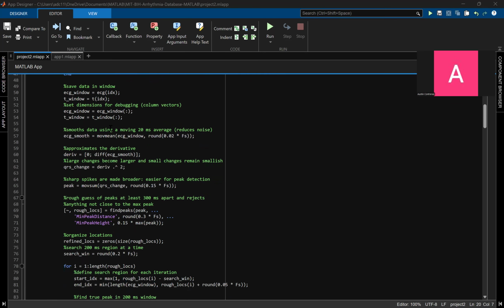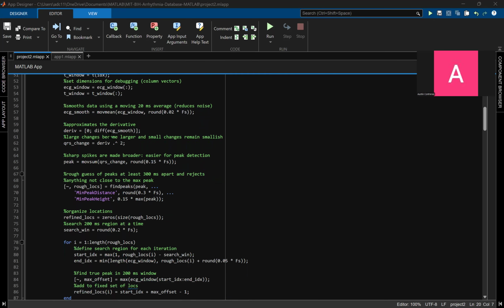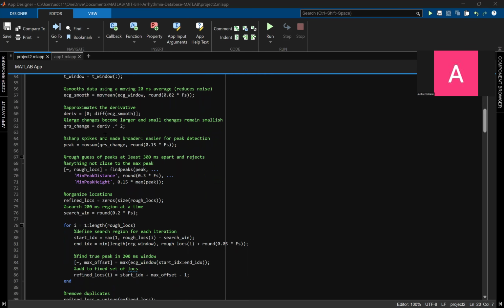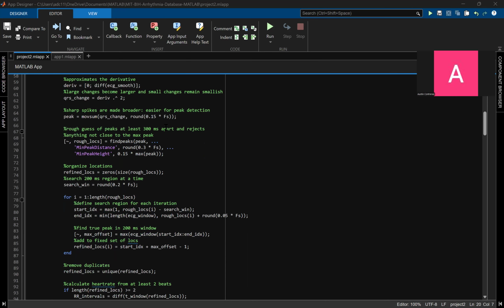And then that's just a smoothing filter, approximating the derivative to find when peaks are changing, amplifying the peaks so it's easier to tell what is a peak and what is not, or the derivative, I guess. And then making sure that the peaks are not just a small area to look at. It's actually something significant, which makes it easy to detect.